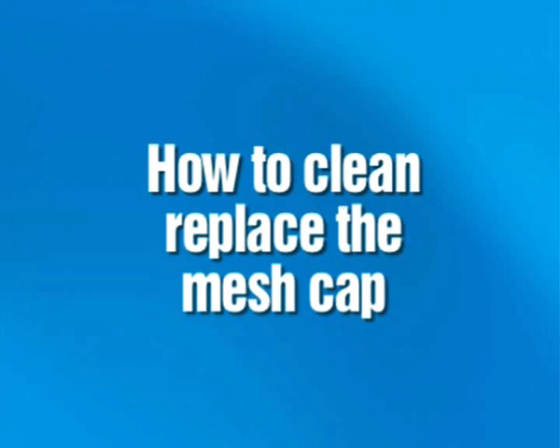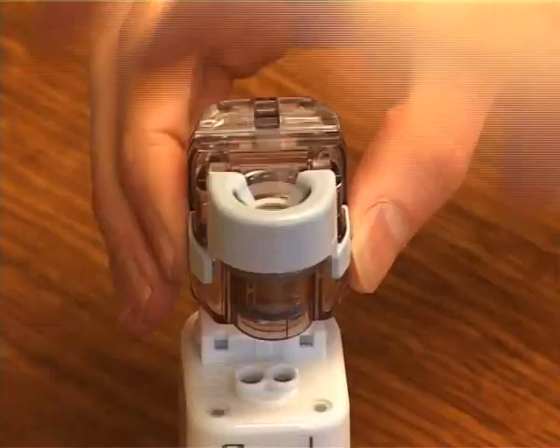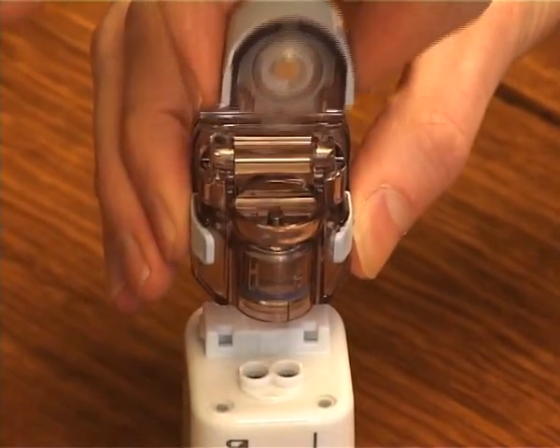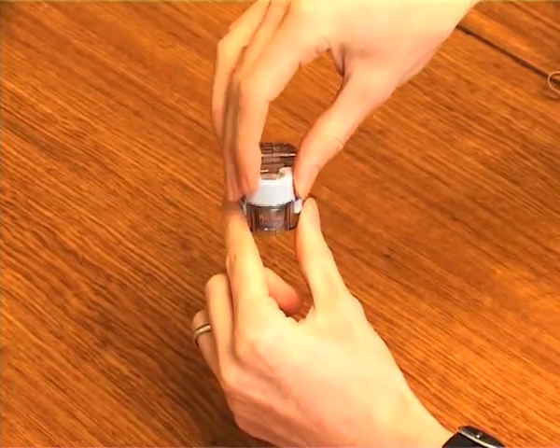How to replace the mesh cap. Remove the medication bottle from the main unit and the mesh cap from the medication bottle. Then install a new mesh cap. Remove the medication bottle from the main unit and store it in a clean, dry place.